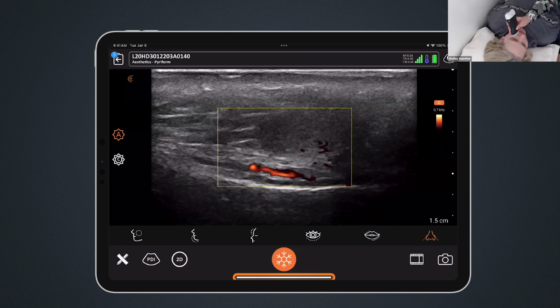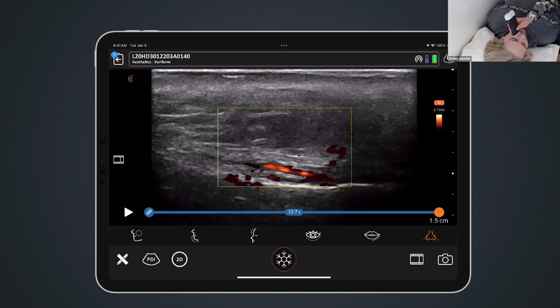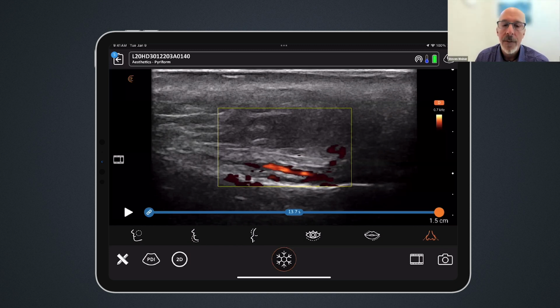Yeah, that's amazing. And we don't have to go through it, but the other side was exactly the same, right? Which they're not always. Right, it's actually quite unusual for both of them to be on the bone like that.